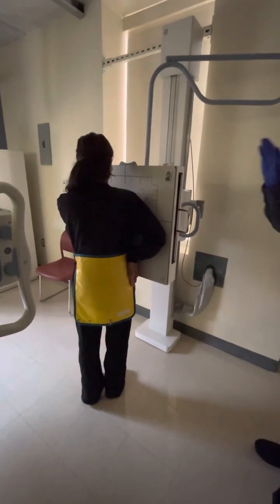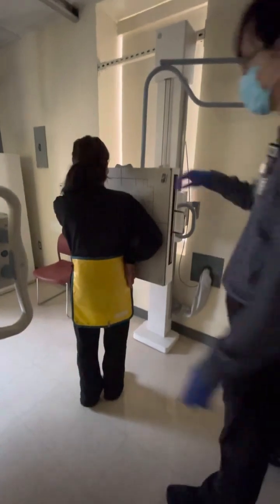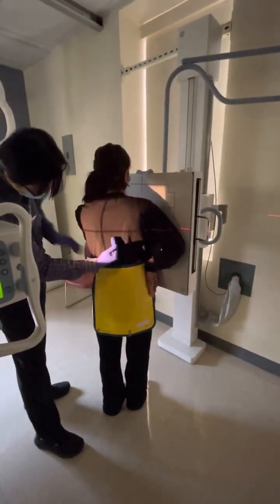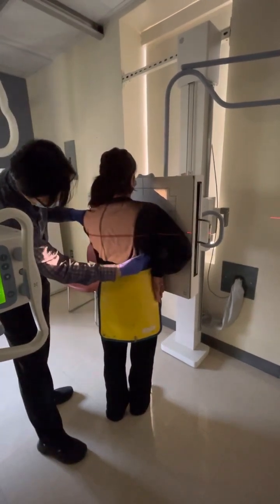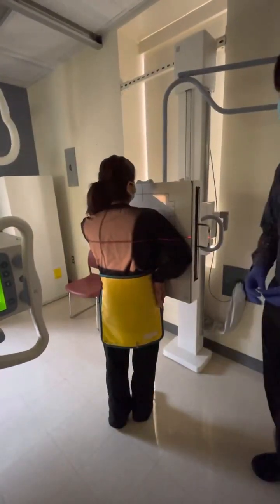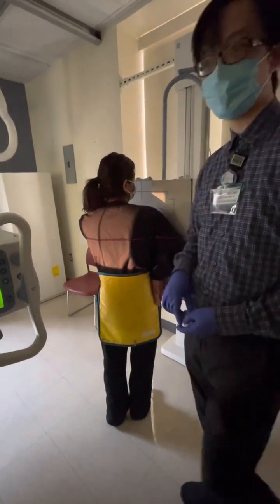Any questions about unilateral versus bilateral? No? Right, in that case, which side are we going to mark here? The right side? Sorry, I moved it a bit too far. You're looking at the left, so wouldn't it be the left? Okay, yes, so which ribs are we? The right is touching the IR. All right, that's right. So right side is touching the IR.